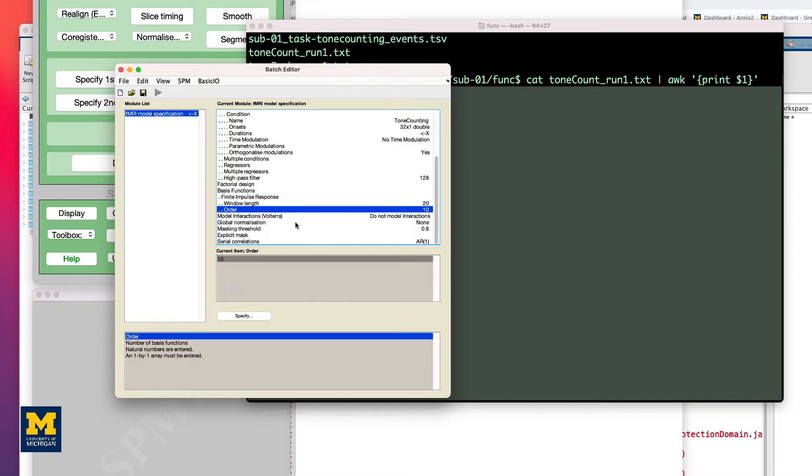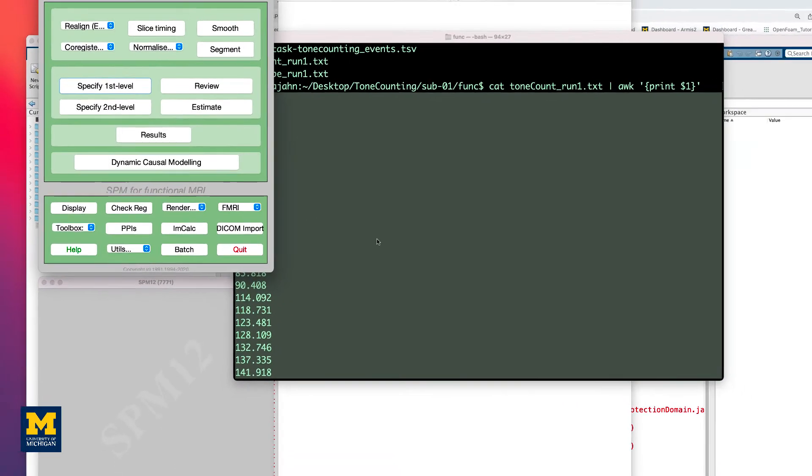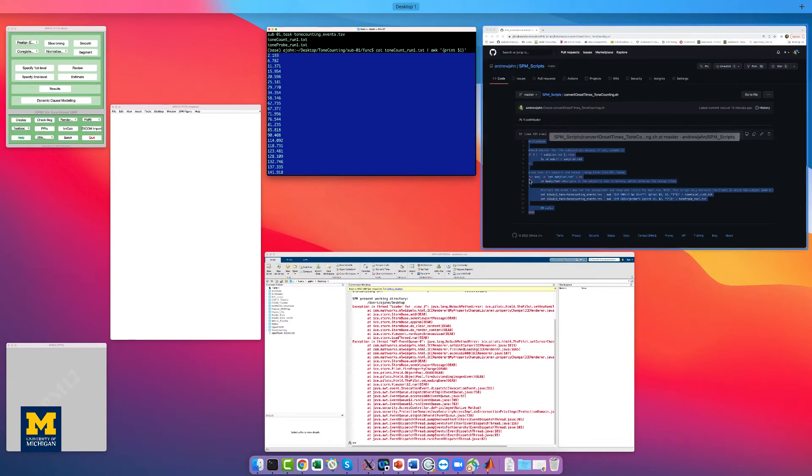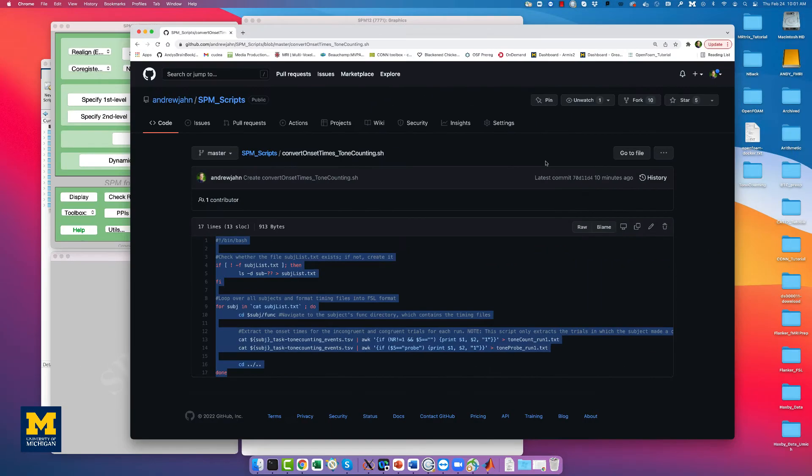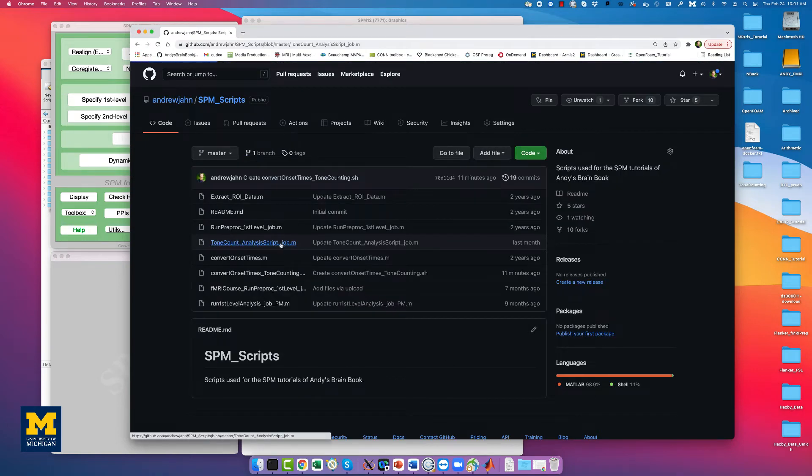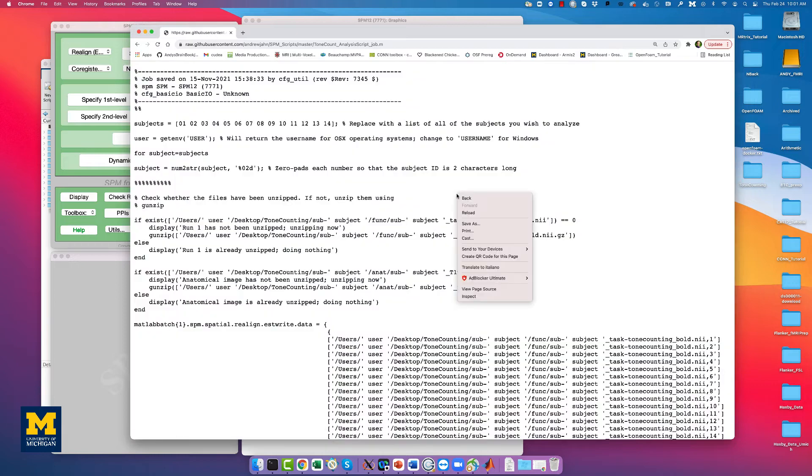However, we have a script that will run all of this for you, both the preprocessing and loading the onset times into a first-level model. Go back to the GitHub page, go to SPM Scripts, then click on Tone Count Analysis Script Job, and click on Raw.